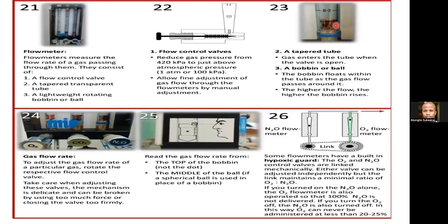So yeah, can you see? So that's what I was meaning. So here it's off because the bobbin is not spinning, and also it's at the bottom. But as you open it, it will start rising. And I did mention that it's not this dot that will help you to know the flow rate, it's the top of the bobbin that tells you about the flow rate.